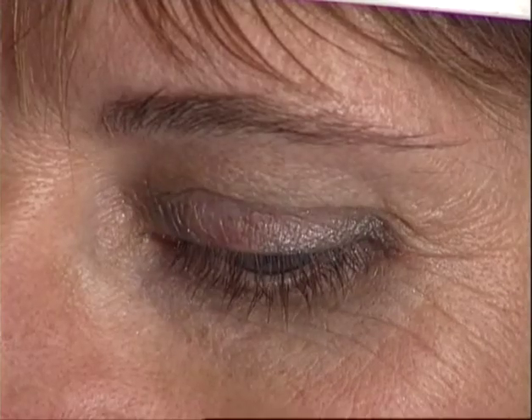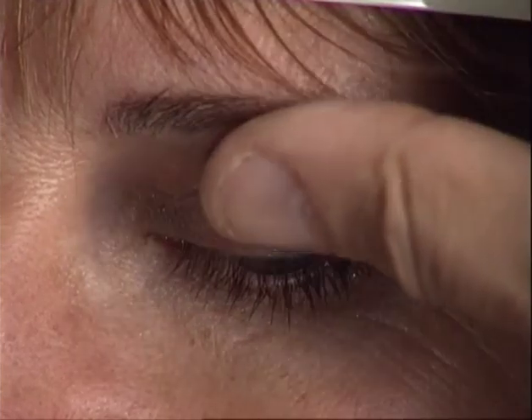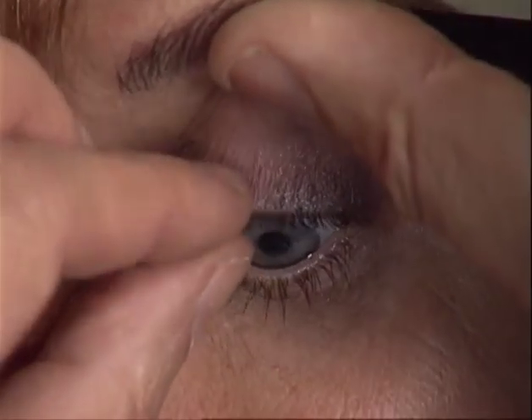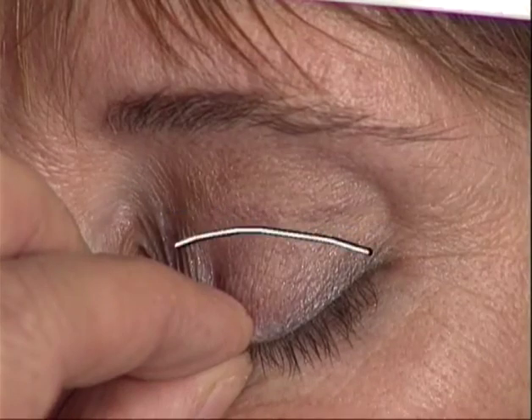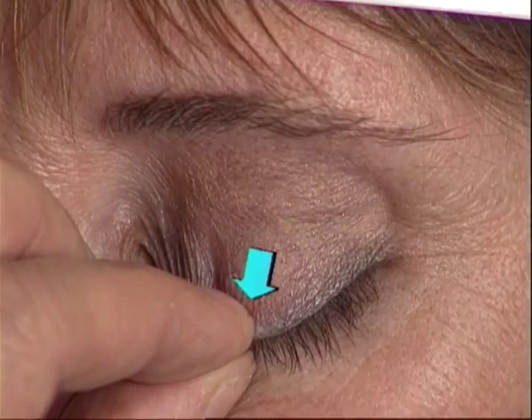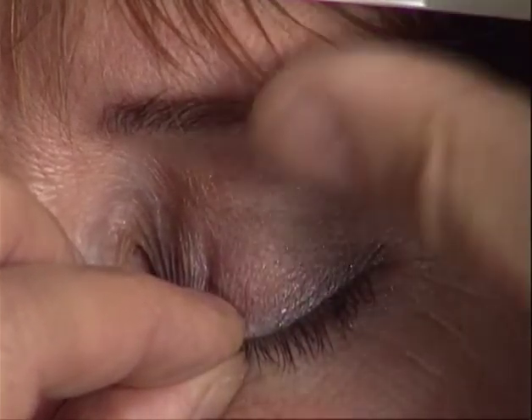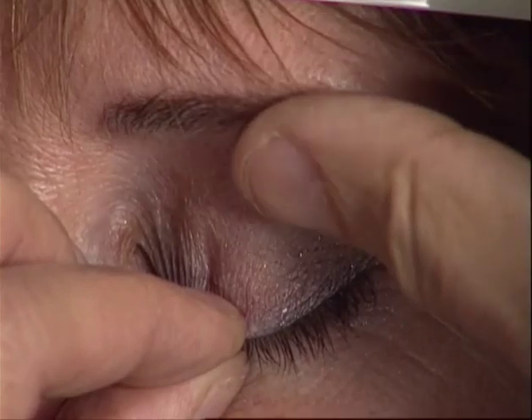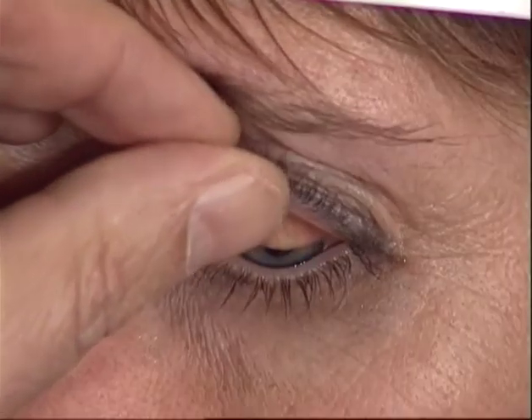To turn the tarsus about the axis of rotation, which is an imaginary hinge line between the inner and outer canthus, the tarsus should be pulled downwards until its superior margin is slightly below the hinge line. The superior margin of the tarsus is recognizable by a depression appearing in the lid skin when pulling downwards. Note, an ample downward pull is the essential point in this technique. A slight touch of the fingertip immobilizes the upper lid skin above the upper margin of the tarsus. Then the tarsus can be rotated easily about the hinge.